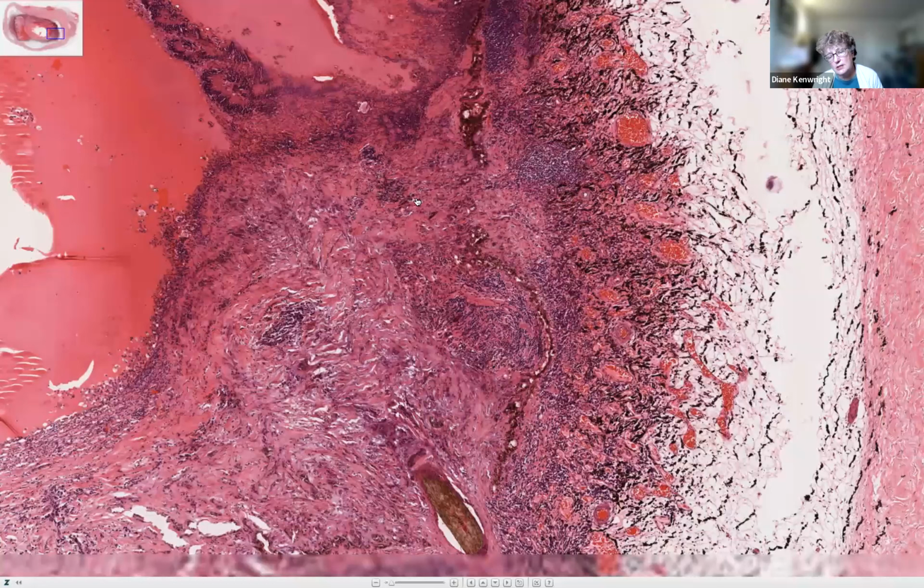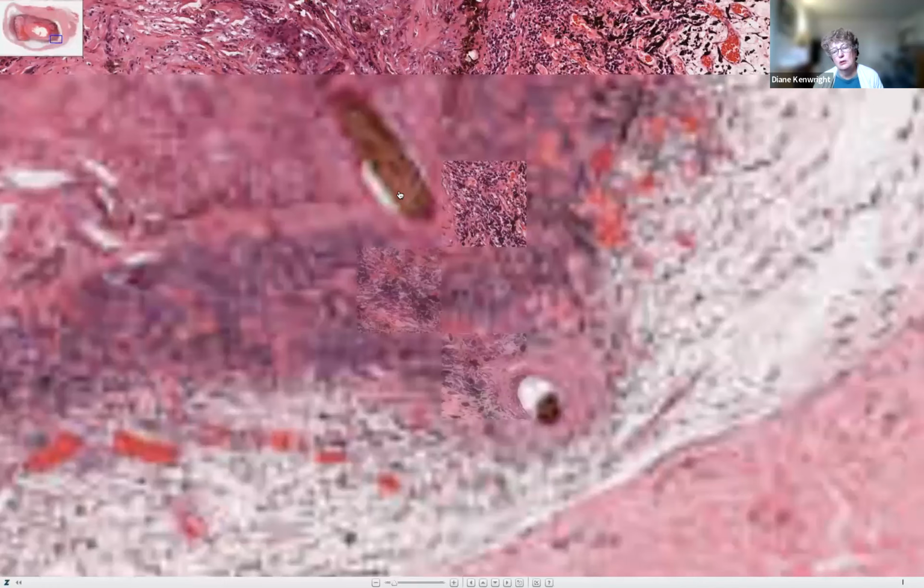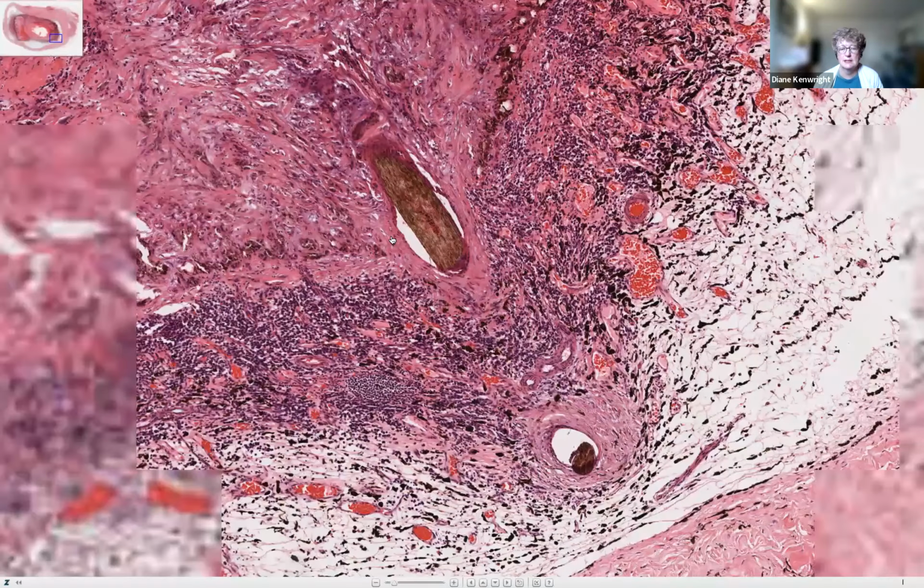And then, oh look, what's this? This does not look normal. This looks like a penetrating eye injury, right? So this is a foreign body that's in this eye. What is the foreign body? It's kind of brown and looks vaguely like a bit like wood. So I'm going to say that there's a stick there in the eye. Probably chopping firewood without glasses on and a splinter. Something like that.